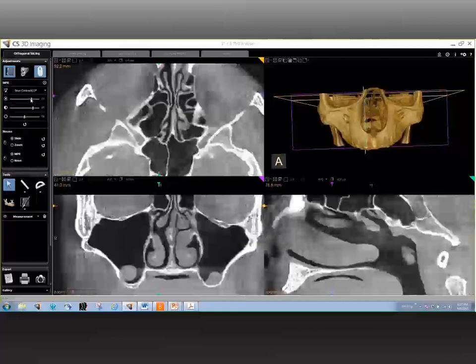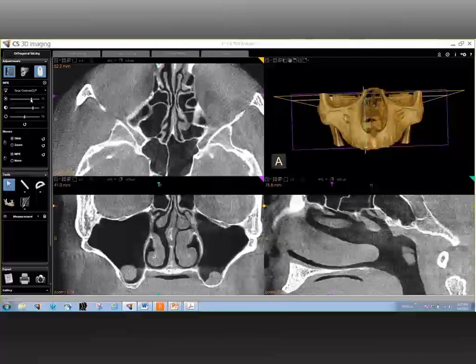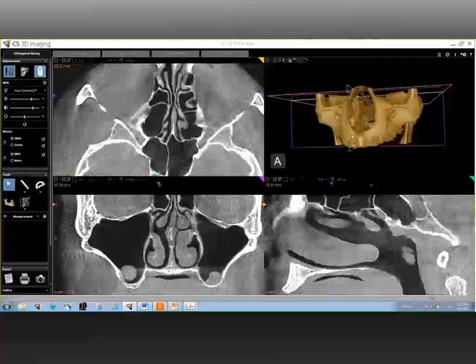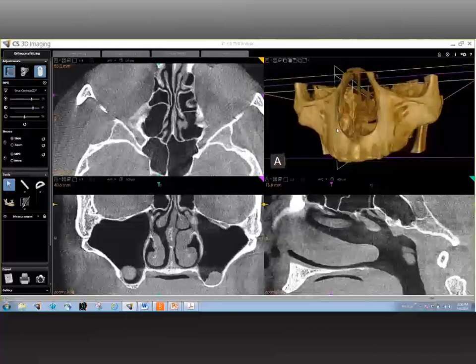So as long as we're on the subject of limitations of cone beam CT, I understand that caries detection, caries cannot be diagnosed either. Would you care to comment? That is very good. It is a good point. Now, doing a CBCT scan to visualize caries would be certainly an overkill, and it is not advocated for that. For caries diagnosis, the traditional intraoral methods probably hold the best. Your bitewings, your regular periapicals that you do, those are all the modalities that you probably need to rely on for now as it comes to diagnosing caries.